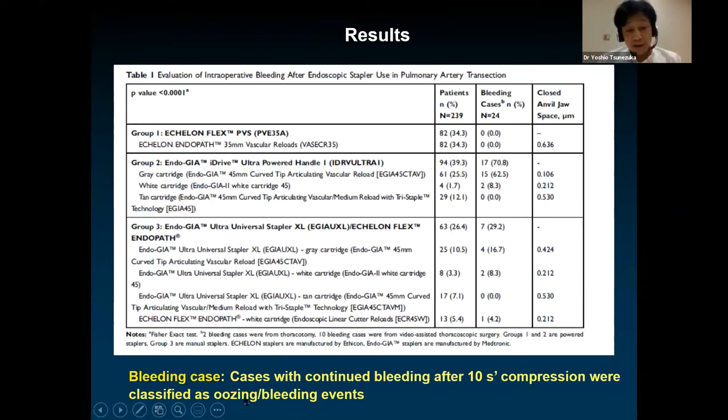And bleeding cases is a definition. Intraoperative oozing or bleeding is difficult to define, but in this paper the bleeding point goes for about 10 seconds. In more bleeding continuous cases, we need further compression and use a soft coagulation device or suture to achieve complete hemostasis.